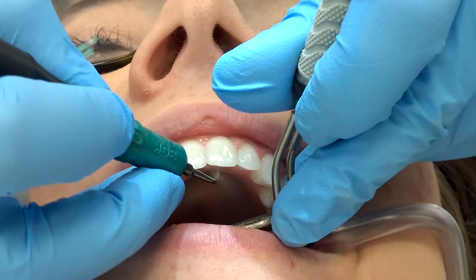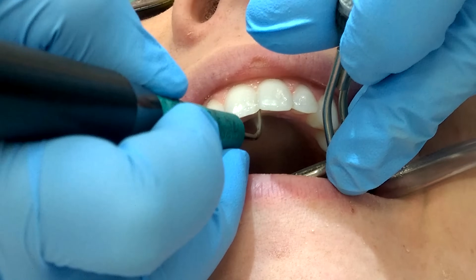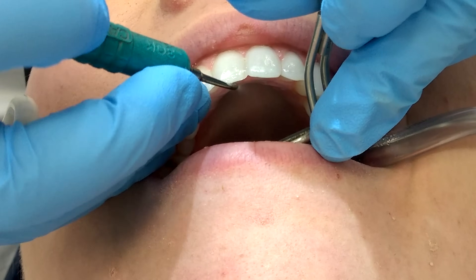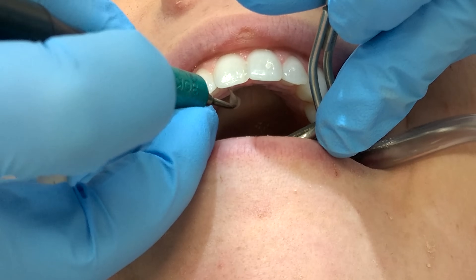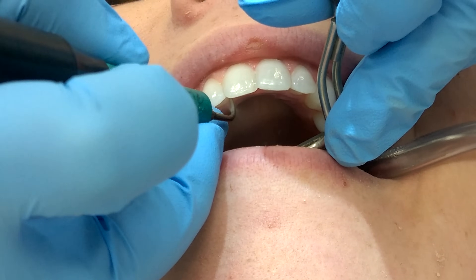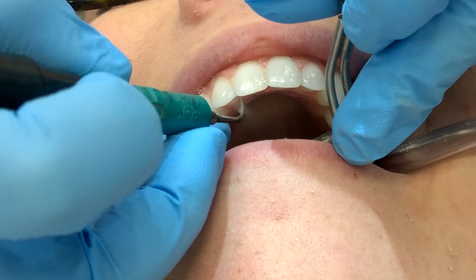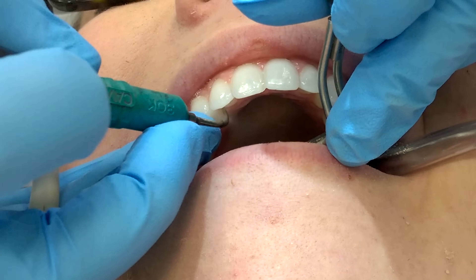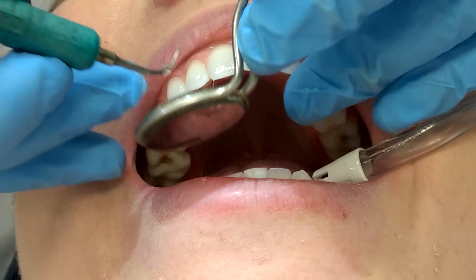Now I'm going to move up to 12 o'clock and do all my away and toward surfaces on my anterior teeth. You can do this with the ultrasonic because there is no cutting edge.